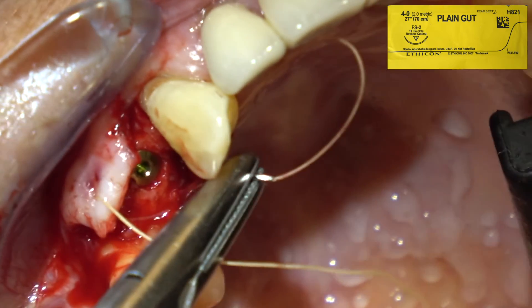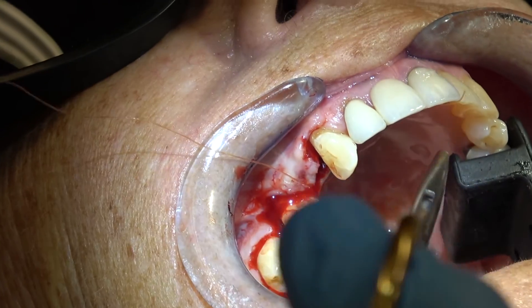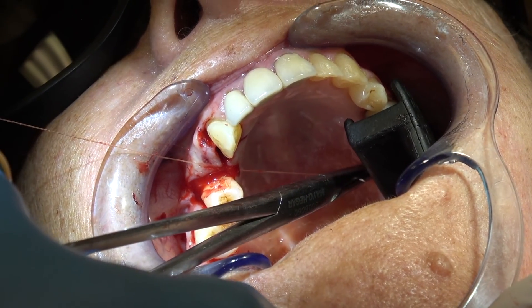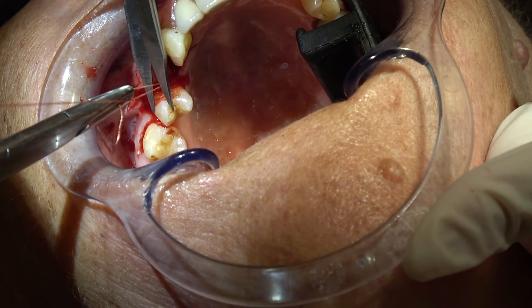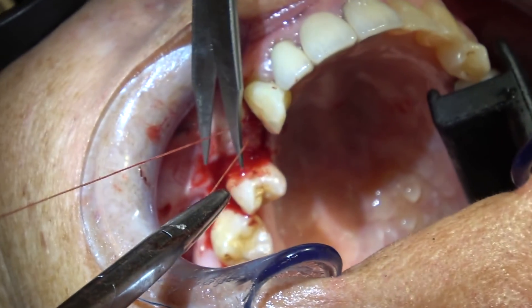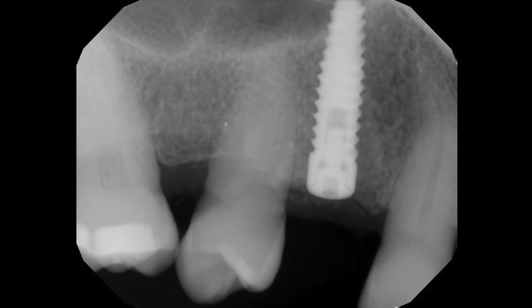4-0 gut suture — I'll place two to three sutures. We've placed three 4-0 gut sutures. There's the implant.